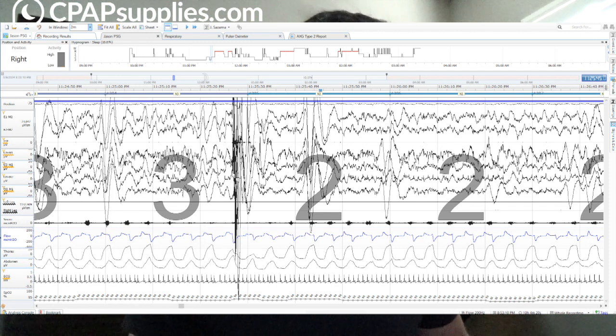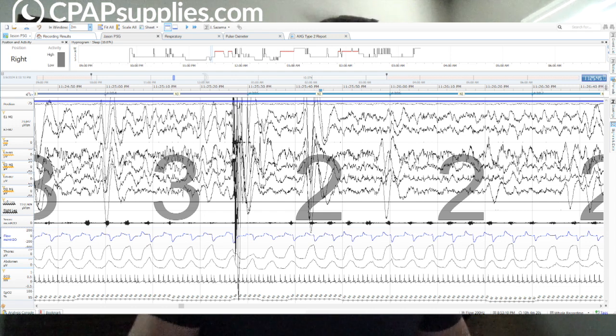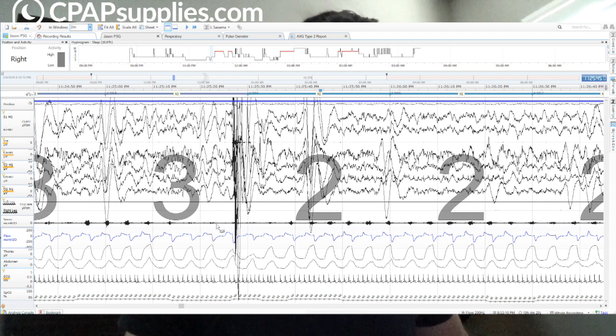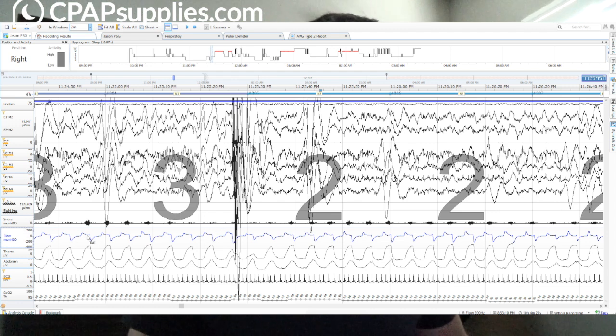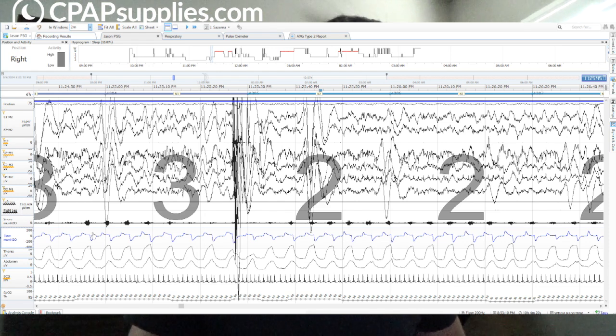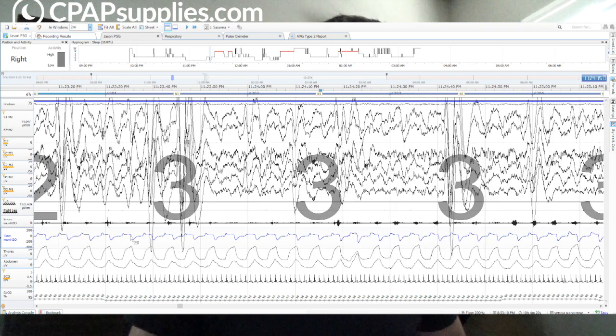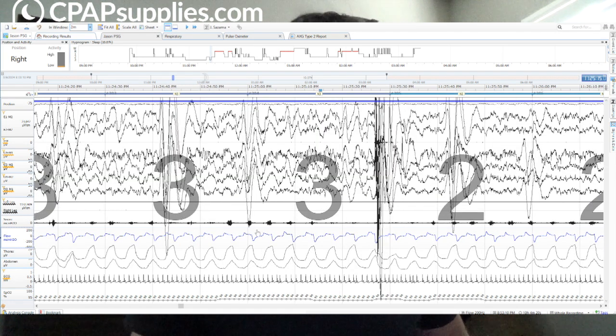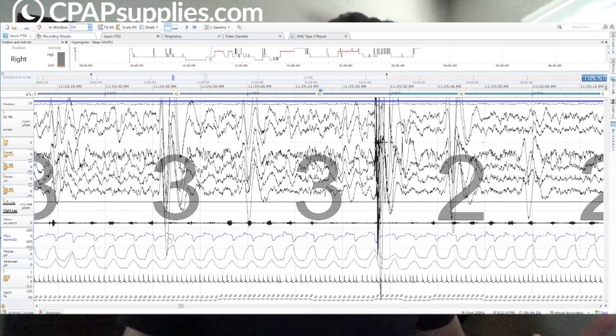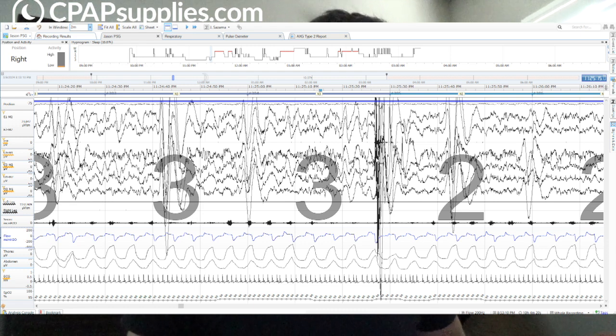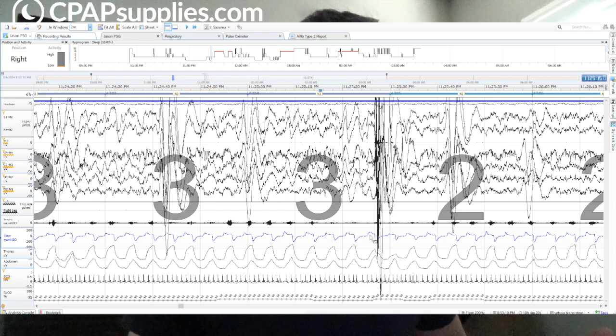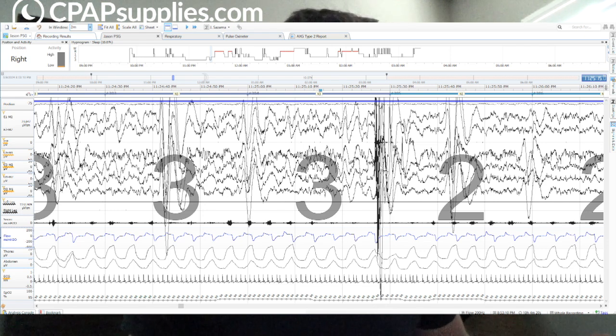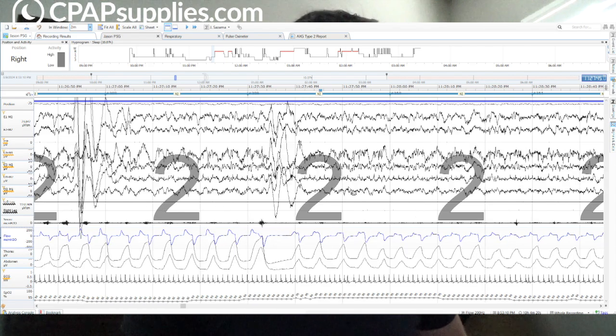Okay, so this is interesting. We have an awakening. I didn't actually flag it. My bad. This I should have flagged as an awakening but there's no real decrease in airflow that stands out from the background. Nothing real obvious. All the tops of these waves are super flat. So if they had CPAP on, it would probably be a lot better, more rounded. Probably this arousal wouldn't happen, but it did happen. But all of it just looks the same. There's no blood oxygen saturation other than 1% that would be waking them up, but yet they did wake up right there.